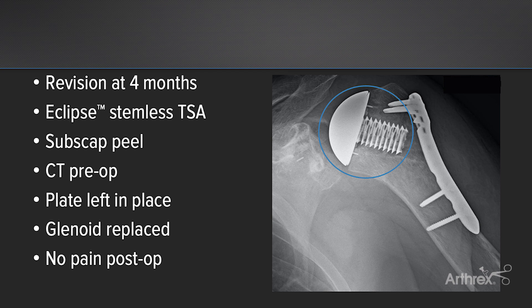At that point, we're able to put a deltoid retractor in there and fully expose the humeral head. One of the things that comes up is how to manage the subscapularis to dislocate the humerus. Generally speaking, for total shoulder arthroplasty, I use a lesser tuberosity osteotomy. However, in these cases, especially in the post-trauma cases for an eclipse, I will do a subscap peel as I want to maintain as much bone preservation as possible.